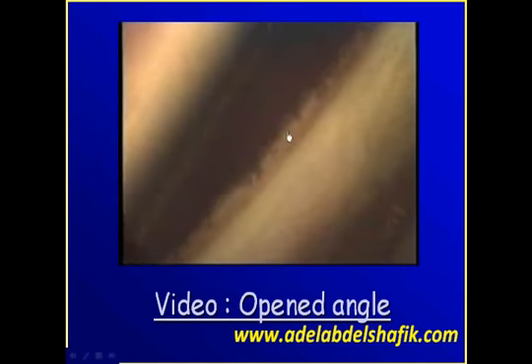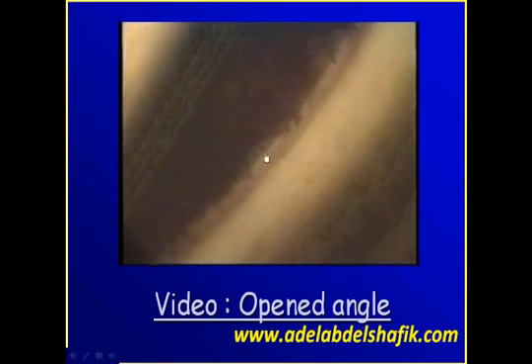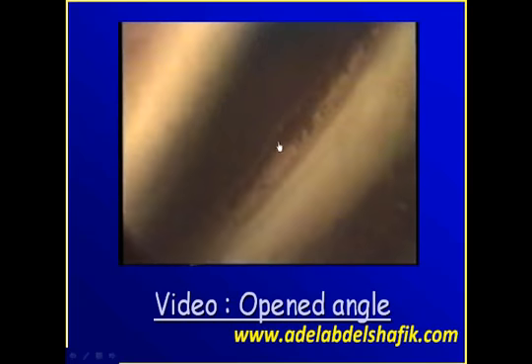So if you see this video, this is the video of an open angle. These fine lines are the iris processes. This is the location of the Schwalbe's line, and this slightly pigmented zone is the trabecular meshwork, and the scleral spur is here behind. This is the scleral spur.